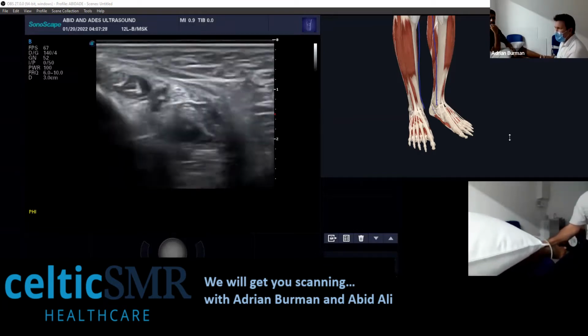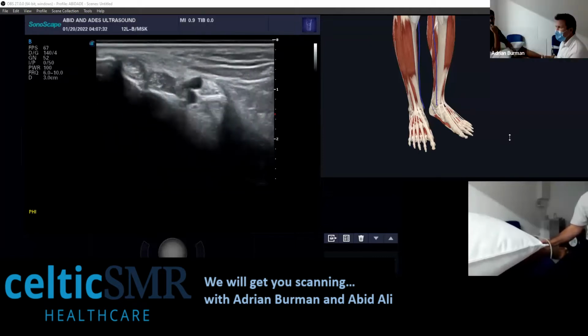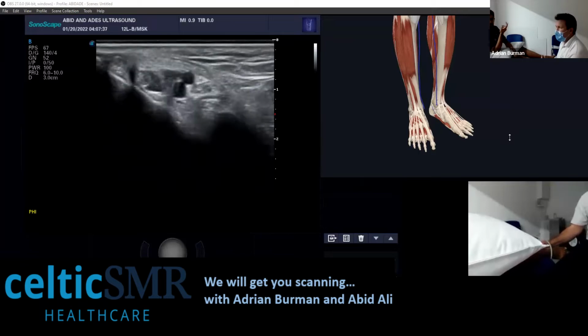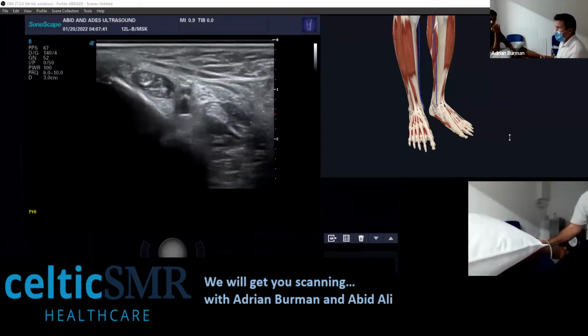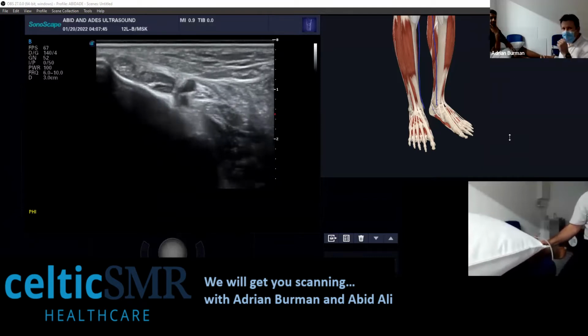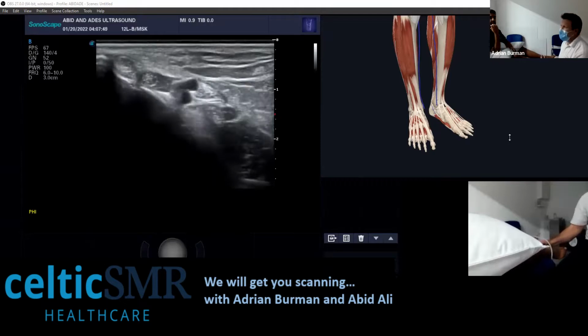Diagnosis. Okay. Yeah, because quite often, if you see it on an MRI, you've got subcutaneous, it quite often comes back as non-specific subcutaneous swelling. Yeah, just defining what layers it sits in. Again, if you put the Doppler on that and it's quite vascular, then I'm probably more likely to say, well, that's cellulitis, maybe.